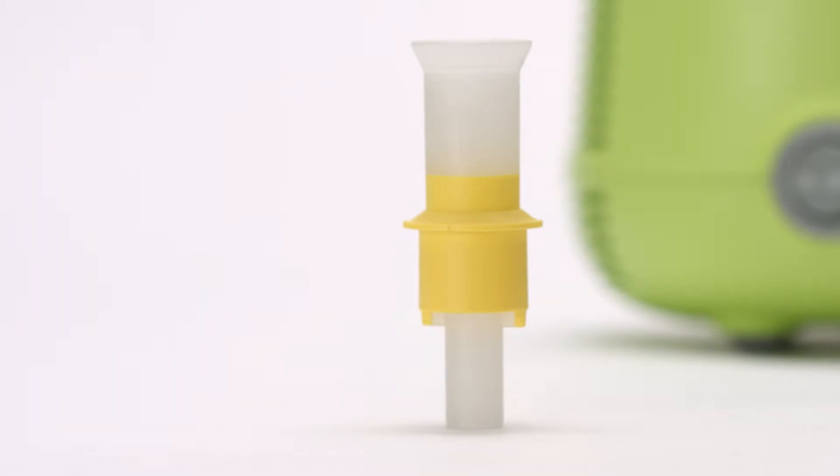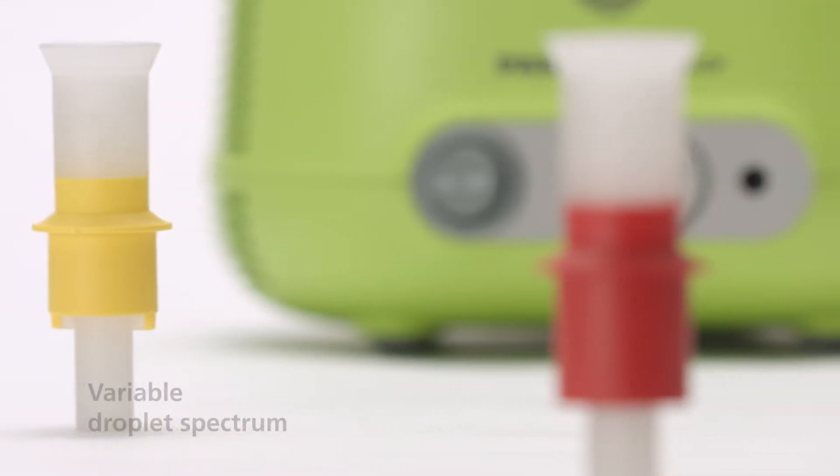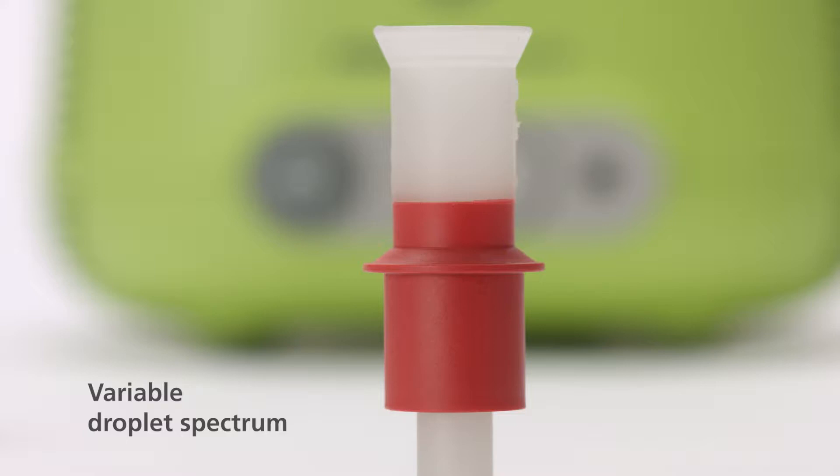The yellow nozzle insert produces fine aerosol droplets to reach the central regions of the lungs in infants. The red nozzle insert delivers the smallest possible droplets for babies aged one month or older, or for infants with constricted airways.